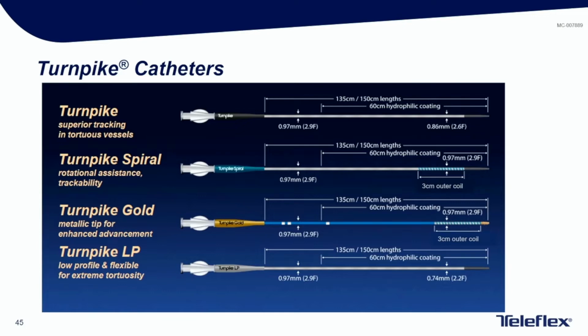We'll go through some cases with regards to how we select the use of microcatheters, and we welcome questions at the end on specific microcatheter selection for the different scenarios that we're going to go over, or other scenarios that you may have encountered in your clinical practice.